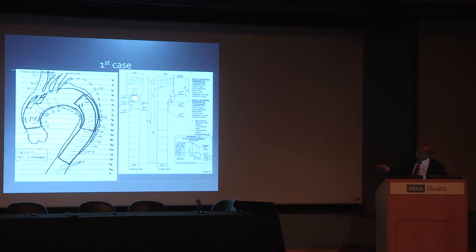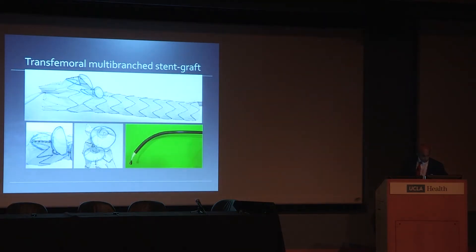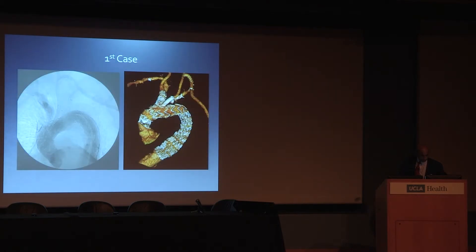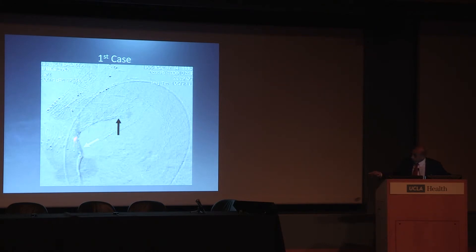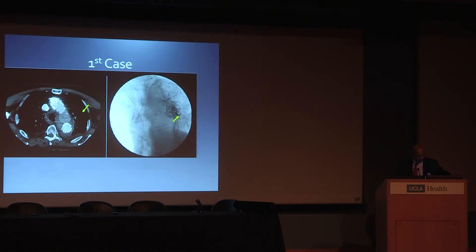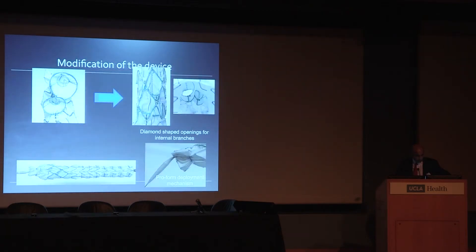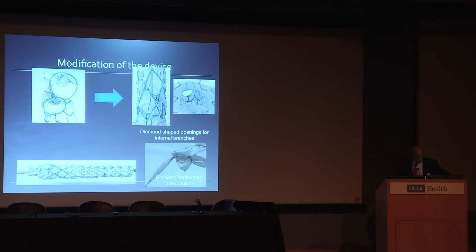The first arch branch case was done in Montreal in 2009 — a good example of what you can achieve when collaborating scientifically with companies. The first device had external branches instead of internal branches. We had a good intraoperative result with no endoleak, but the CT scan postoperatively showed a type 1 endoleak due to poor apposition of the inner curve of the ascending aorta. We repaired that by going retrograde and embolizing the sac. We learned from our mistakes: changed external branches to the current internal branches, changed the markings, and modified the first stent with ProForm technology to address the bird's beak problem on the inner curve. The last trigger wire also allows you to hold onto the device while placing the second piece, preventing the branch graft from being pushed proximally and ruining the arch repair.